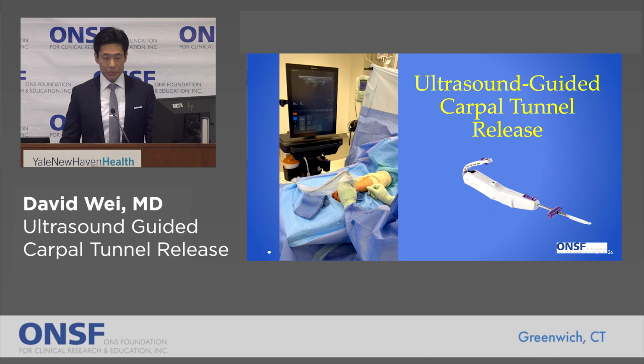I want to focus on this because this is really why I thought this talk was important. So ultrasound has changed the way I diagnose carpal tunnel, but it's also changed the way that you can treat it. And this is not to say it's for every patient, but in the right patient, an ultrasound-guided carpal tunnel release can have even less invasive effects and just as effective treatment.